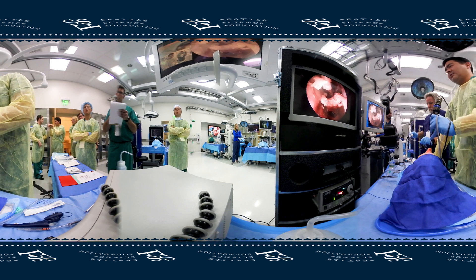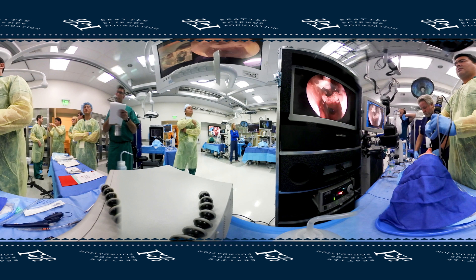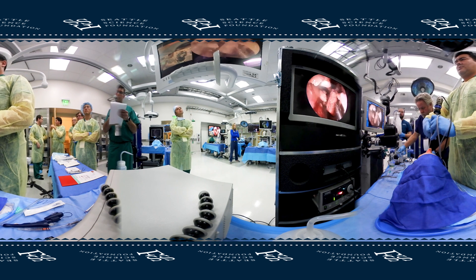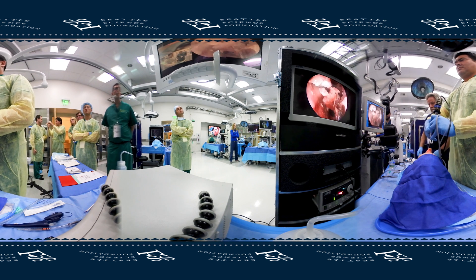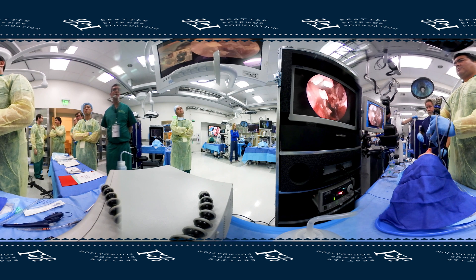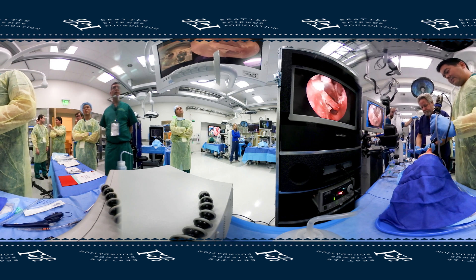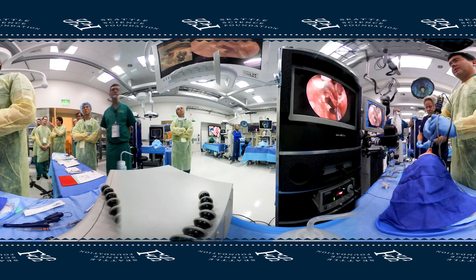Let me have a straight through cut. We're just going to go ahead and resect this. In the interest of time I'm just going to yank it out. But again, that stump you would definitely want to do something about and cauterize it at the end of surgery.